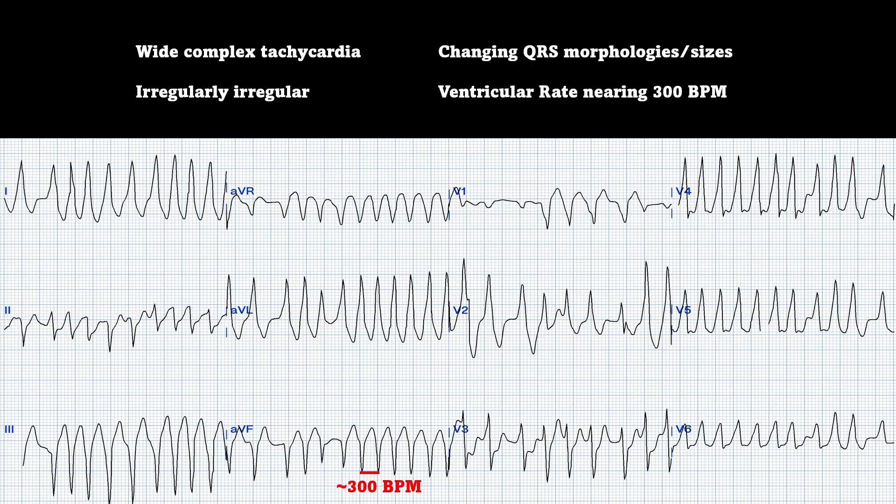The ventricular rate is nearing 300 beats per minute. Your normal AFib should never go near 300 beats per minute. Think of all your AFib with RVR patients and think of the highest rate you've ever seen — you're thinking 170, 180, 190, maybe 200, but nothing nearing 300. When you see 300, that's when you start thinking of pre-excitation syndrome, such as Wolf-Parkinson-White.